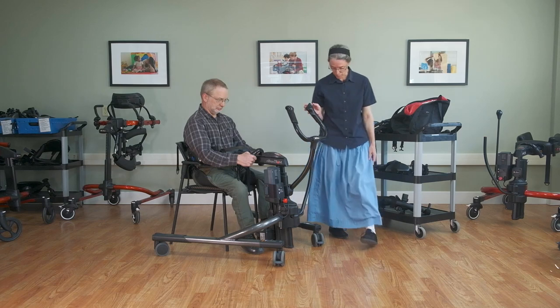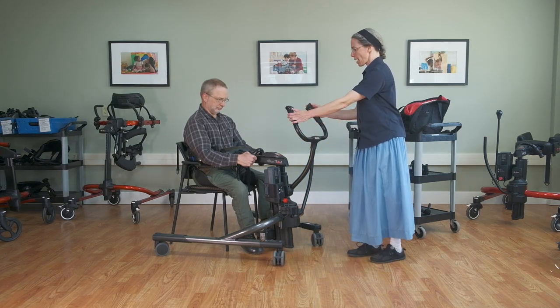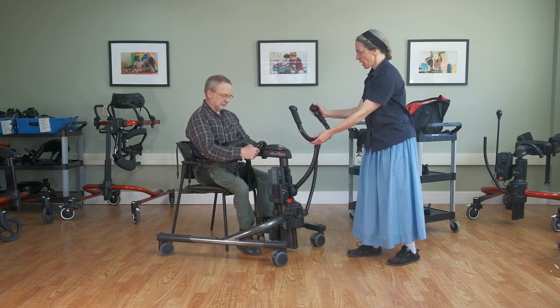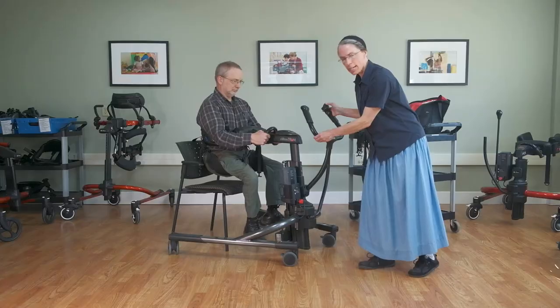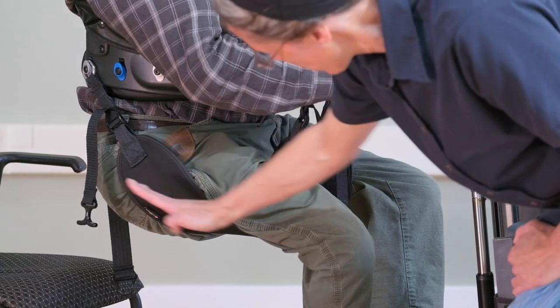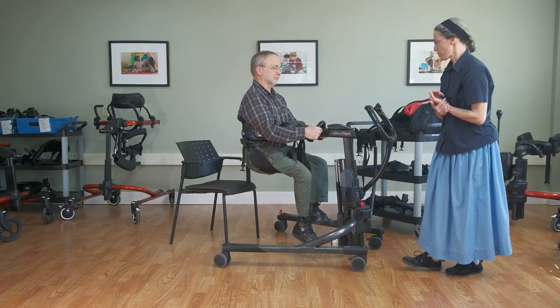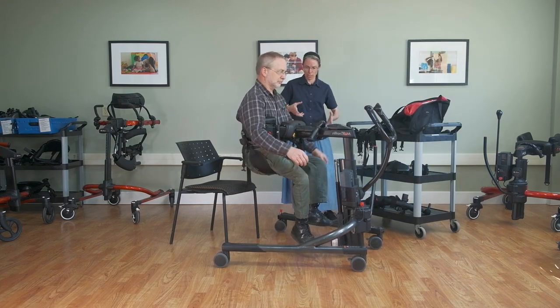Here comes our seated transfer. I'm going to press the up arrow. What we're looking for is that the thighs are approximately horizontal to the floor and that he's not slipping forward or slipping back. It will definitely secure him in place.